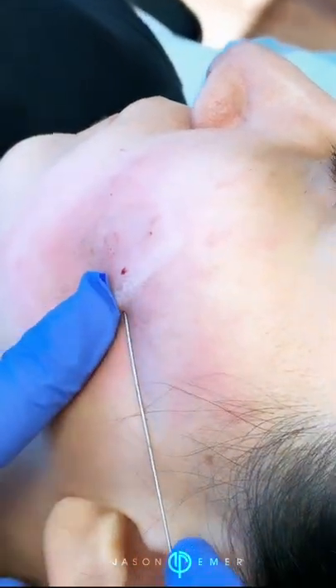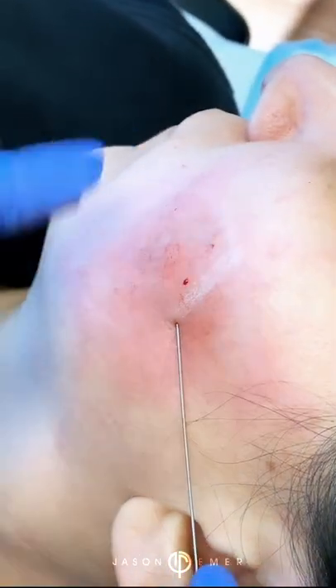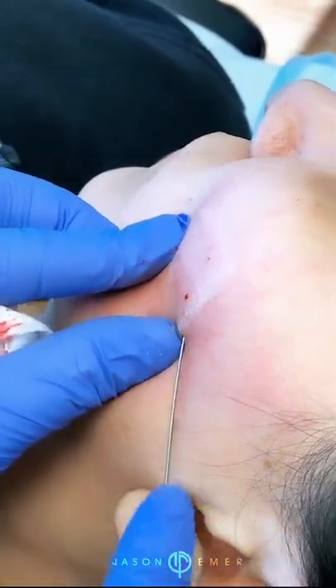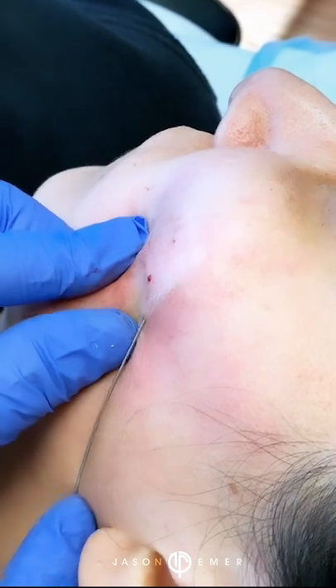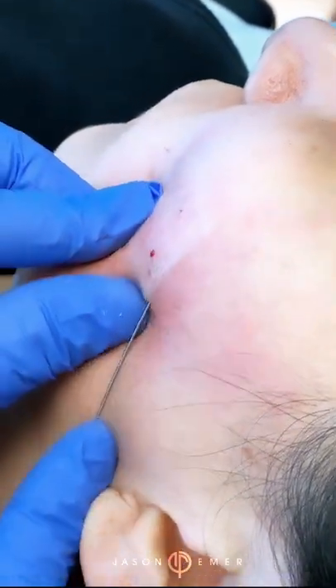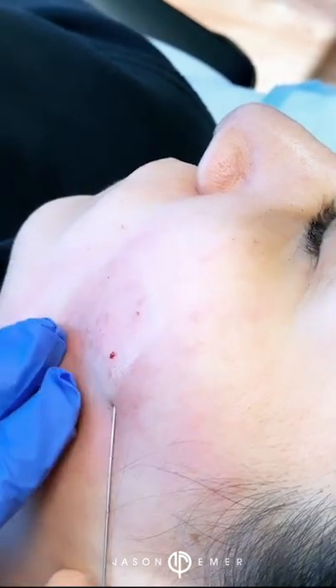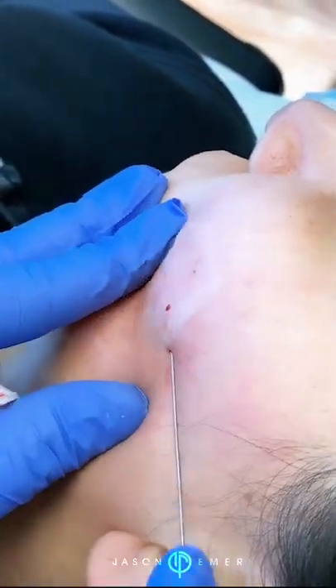So if you guys can see, here's the area that we're subsizing, and here there was a very deep scar. Look at my cannula now — as I move through, there's literally no break, no issue while I'm moving, and that's because we've literally lifted all of those tethered scars.